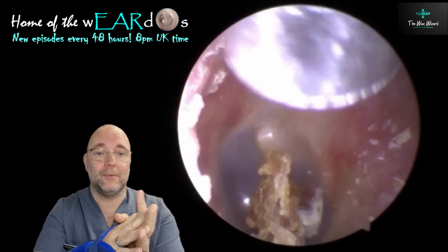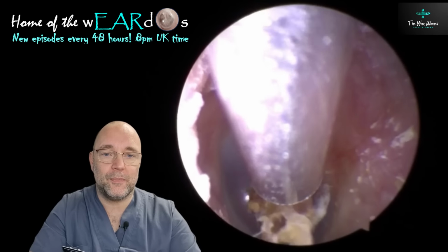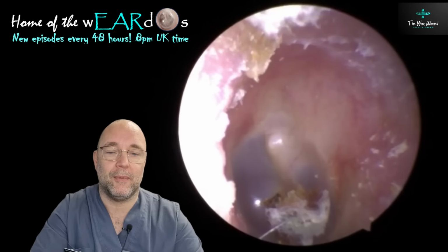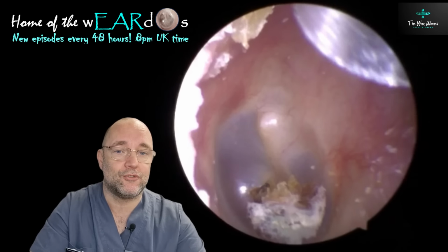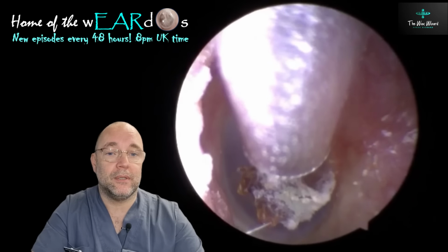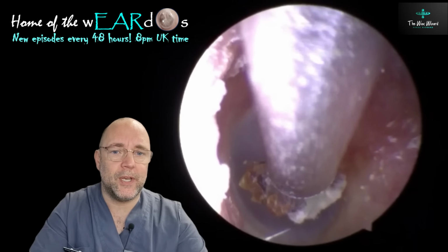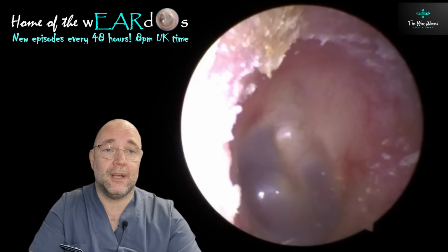But anyways, you can see while I've been waffling on, trying to get this out has been a bit tricky because of how dry it is, but it still came out. It's extremely dry, this here. I mean, I've never seen it this dry. It goes to show that it really helps when he uses regular olive oil. I'm not sure which episode it was that he's been in before, so I couldn't tell you to go and look at it so you can compare the difference. I haven't got the foggiest.